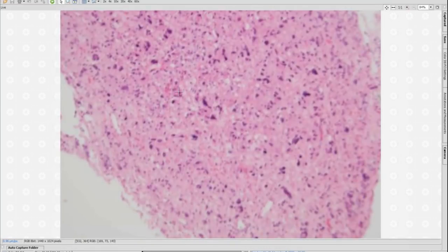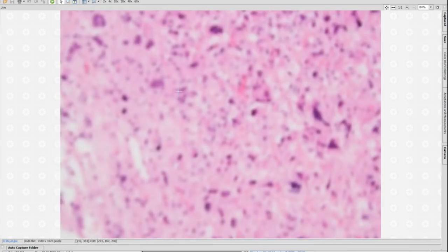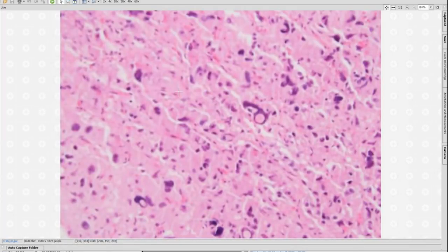And this is a tumor, a case that I received in consult just recently. It was very puzzling because, from the morphologic standpoint, there's a wide differential diagnosis, actually. Well, there was some concern: could this be a metastasis? I mean, you can have a variety of metastatic carcinomas, even a sarcoma. It had several pleomorphic cells scattered around.